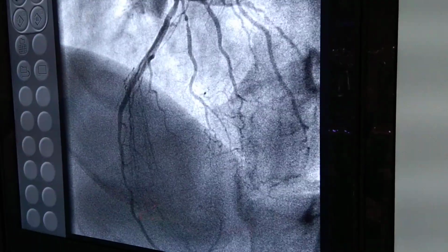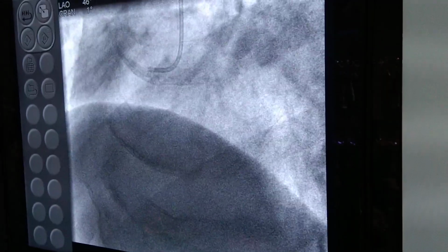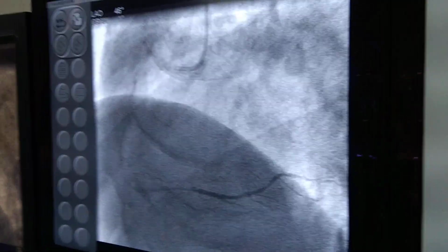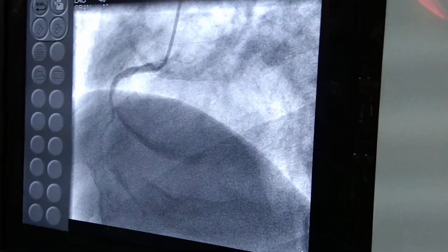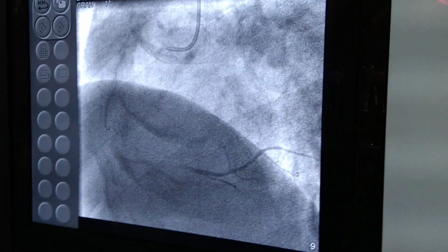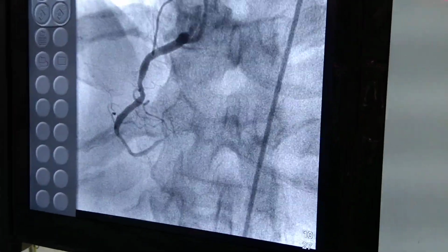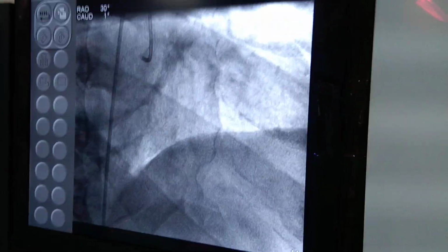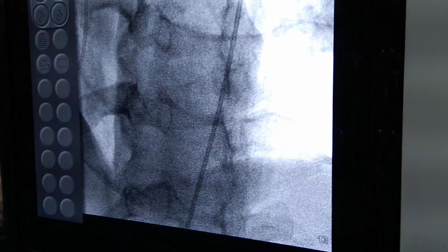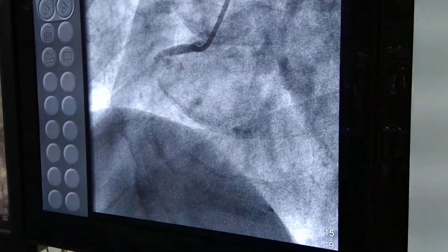Again this is the view, and I would like to show you the right coronary artery, which is the culprit vessel. You can see there is a 99% stenosis giving TIMI 1 or 2 flow in the distal segment, but there is disease in the mid segment of about 70%, and again further mid to distal about 70%. So we have to choose. We told the family that this patient requires 3 stents minimum. The diagonal we thought we will not do.